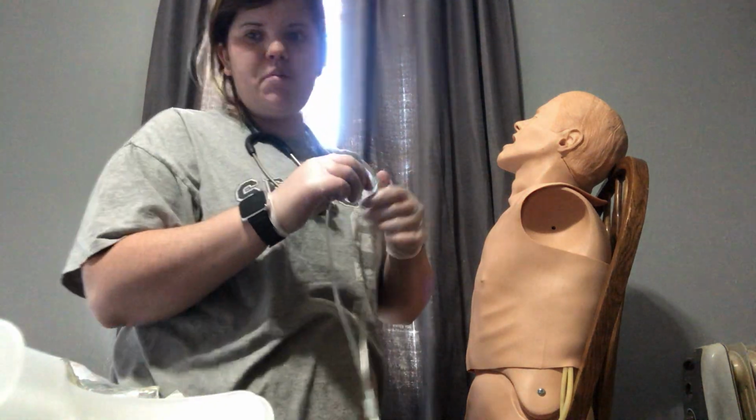We're going to again assess based on the vitals that the patient does in fact need oxygen. We're going to determine the oxygen need based on that assessment. So I'm going to put my O2 tank over here. We're going to start with a nasal cannula at 2 liters per minute. So I'm going to hook this to my O2 tank and going to set the flow to 2 liters per minute.